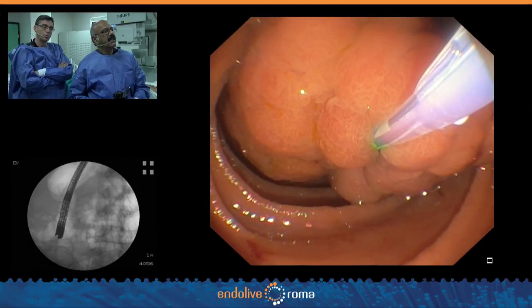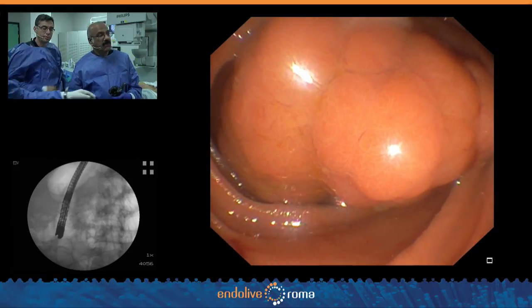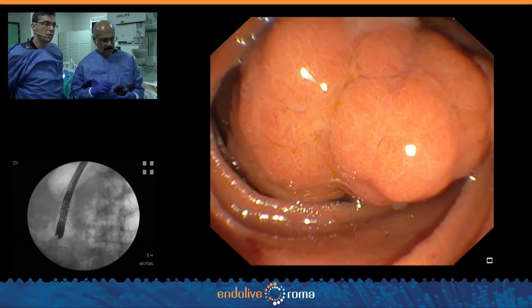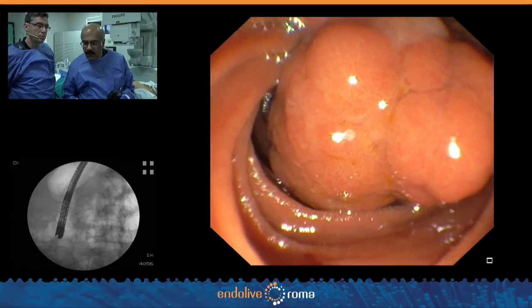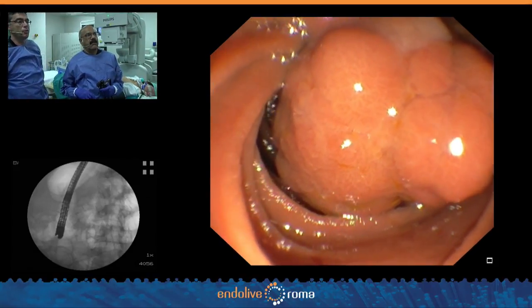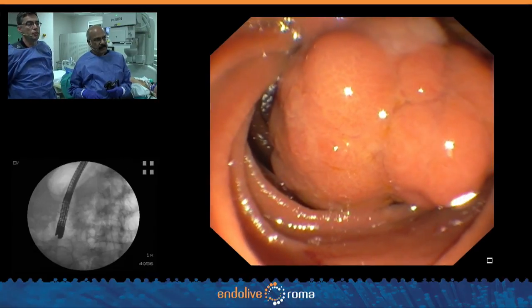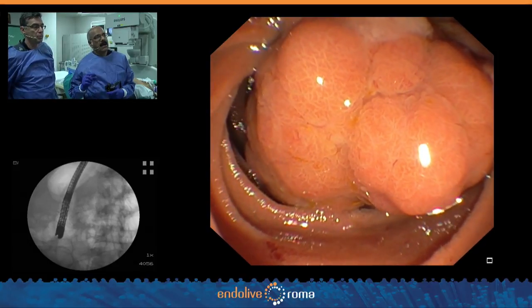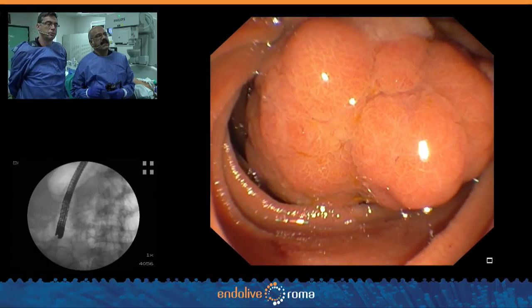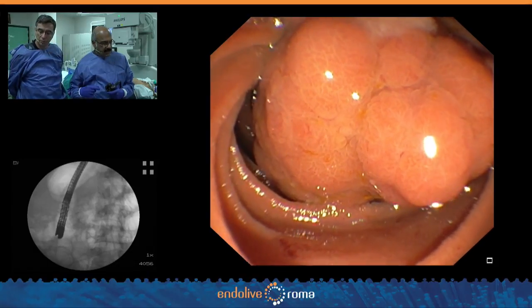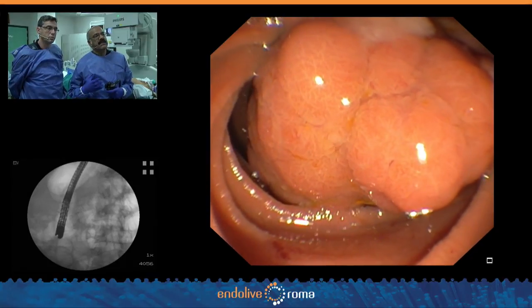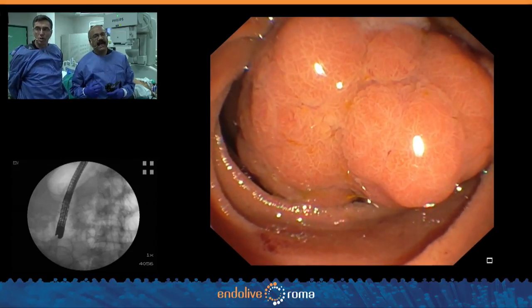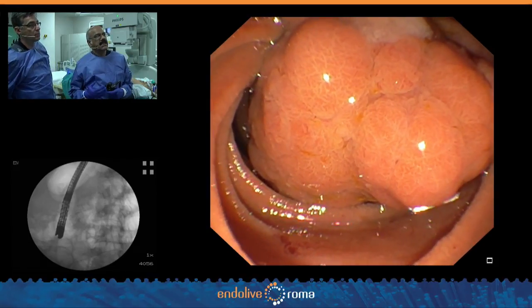We can see the lesion going right there. We can use NBI to look at the pattern — it looks like a benign pattern. Regarding spread of the lesion upstream into the common bile duct: up to one centimeter of CBD involvement, endoscopic removal is still feasible. Beyond one centimeter, adjuvant therapy like RFA can be used to burn it off. The appearance looks benign — a benign adenoma — so it's still an indication for endoscopic removal.